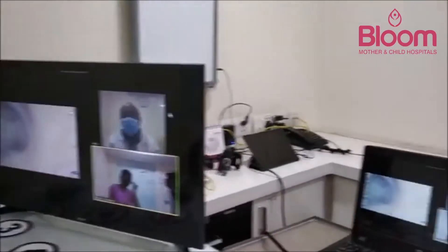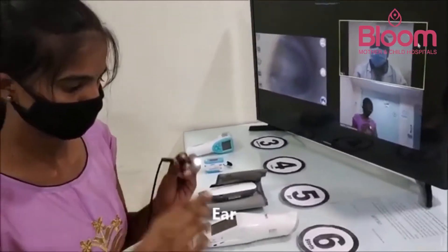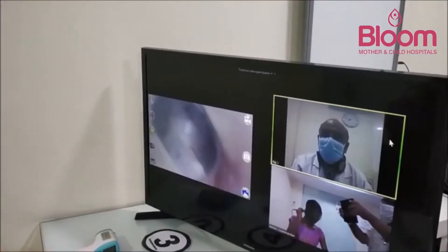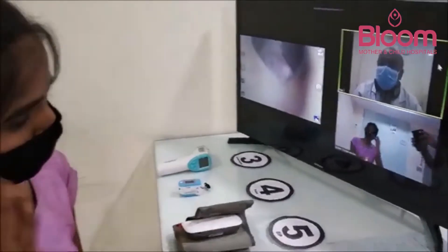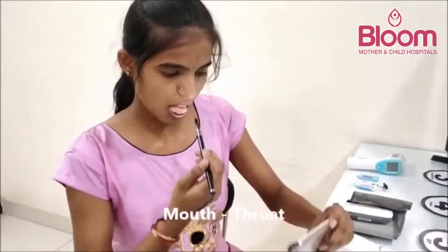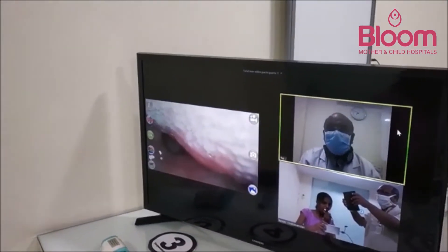The digital otoscope is now in use. The doctor can clearly see Kavita's eardrum. The right side is examined first, then the left side. The doctor captures a very good image of the ear canal.